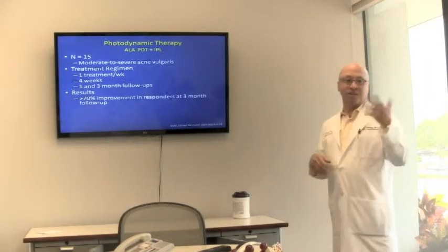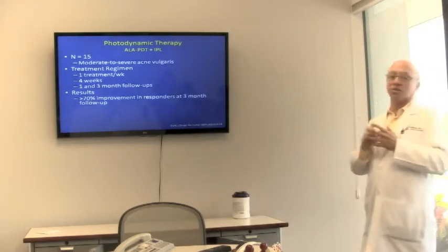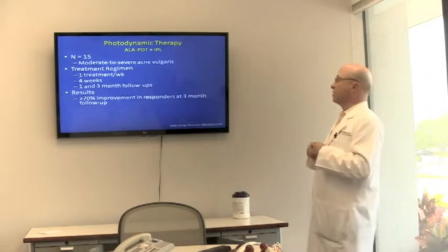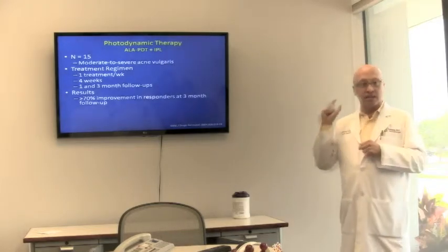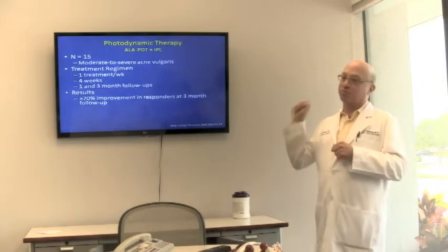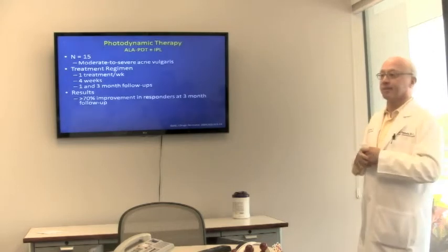And I'll tell you about a kid that I treated a couple of years ago in a couple of minutes, and you'll see what that means. So although the study was done one treatment a week, in real life we treated once a month. They did 4 weeks, and they did a 3-month follow-up, and they saw a greater than 70% improvement. And I think that's pretty typical. Now, that does not mean for a minute that this is curing their acne. But it's working as well as pretty much anything else, and they're not taking the pills.